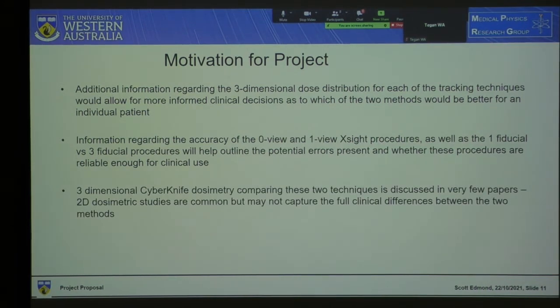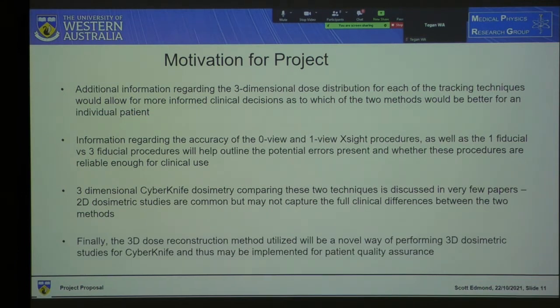Like I said, it's not really discussed in very many papers. 2-dimensional is common, but that doesn't capture the full breadth of a dosimetric distribution. Finally, as I mentioned before, the 3D dose reconstruction method could potentially be utilized in further QA analysis in other centers.